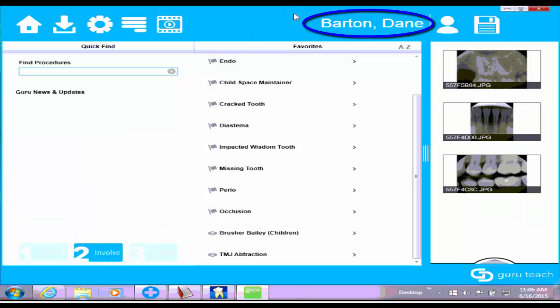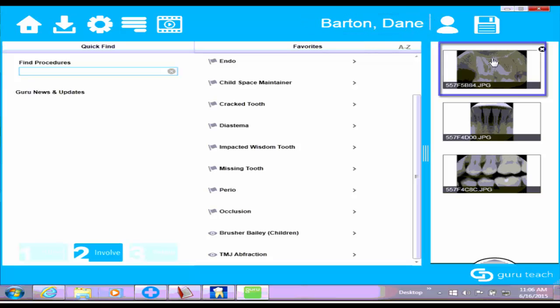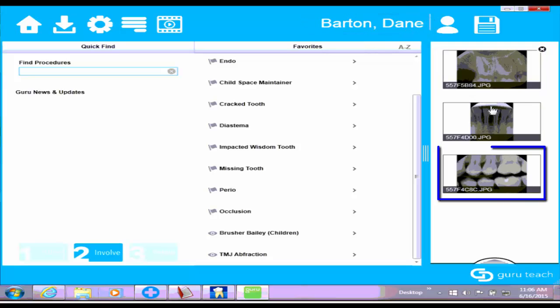It opens up the patient, so their name is right here at the top. You can see here are the three images that I selected. When I clicked on that G icon, it brought them in here.